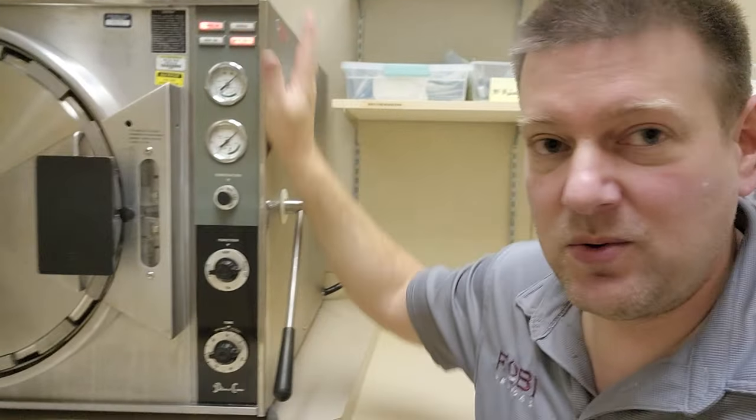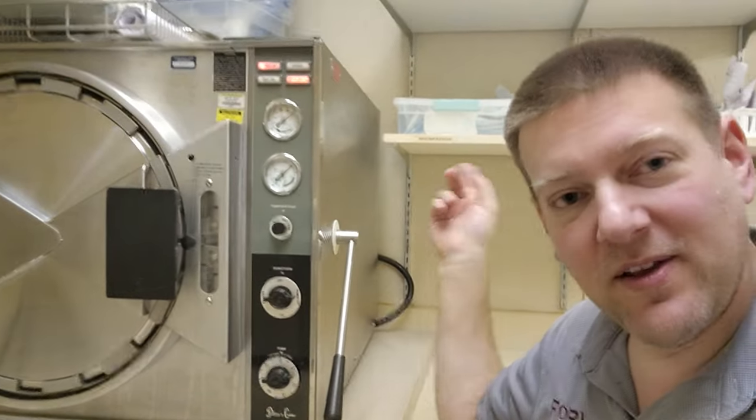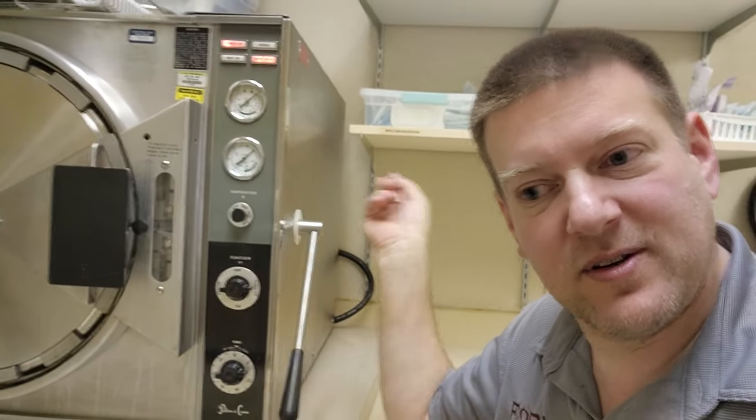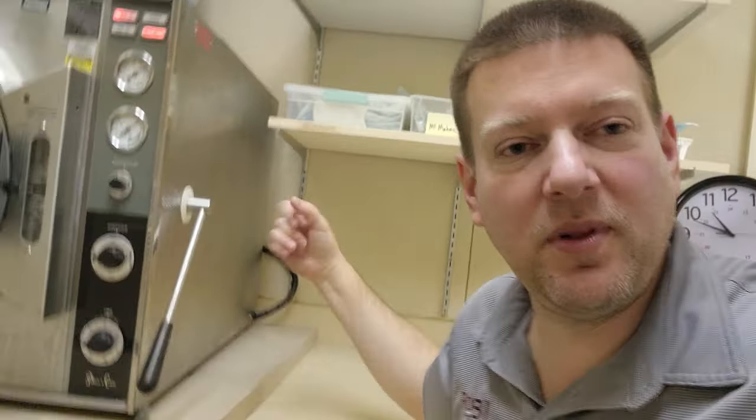This is an all analog manual autoclave. And because of that, because of the bellows not being serviced correctly, it almost started a fire because it's going to continue drawing maximum current on that plug.